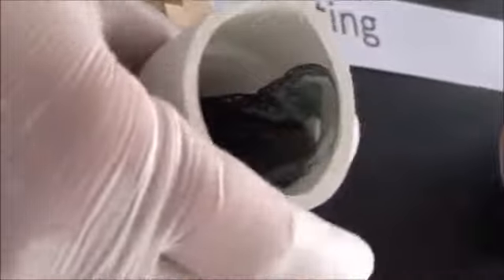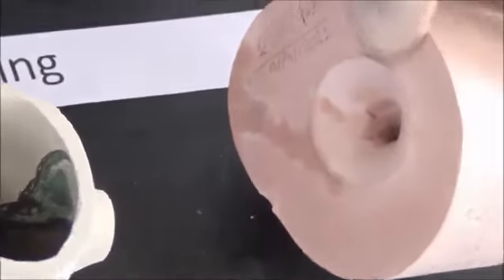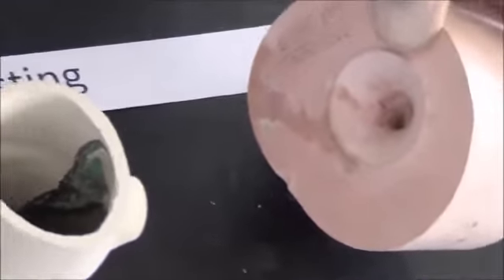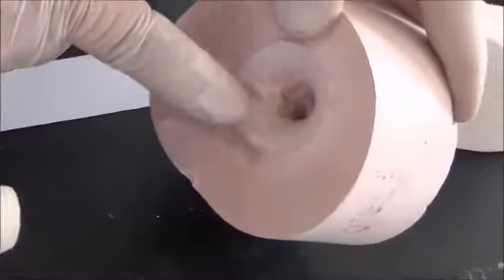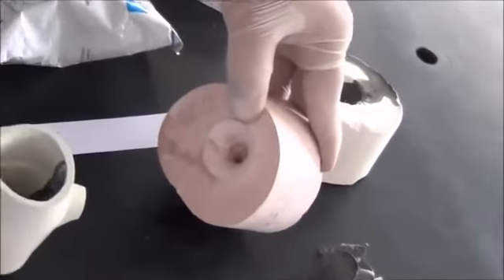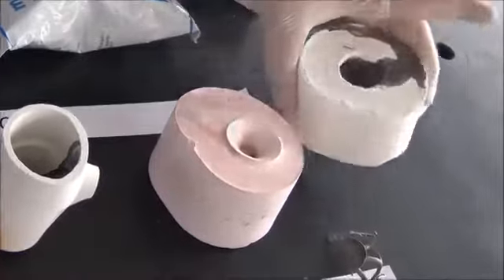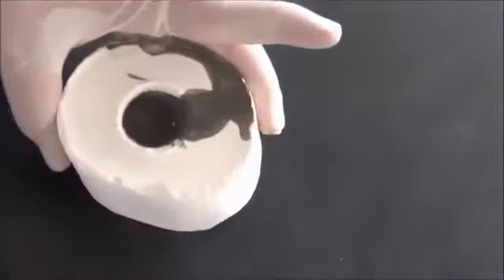It will go out this opening and go through a hot tunnel into the already heated investment ring. The metal will follow the tunnel inside into the empty spaces, and under force it will flow into all of the empty spaces that were created by the funnel, the sprues, and the metal framework wax pattern. So after pouring the metal, it's taken out of the casting machine and left to cool.